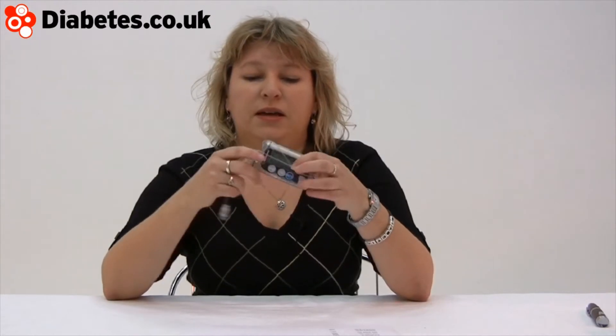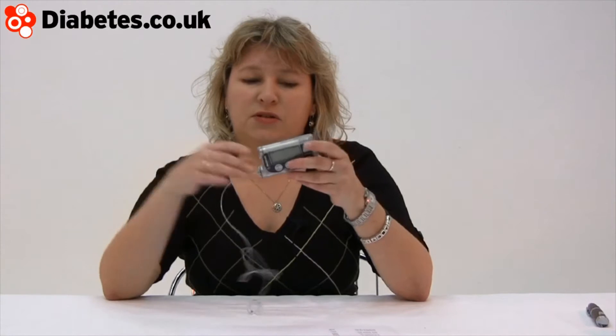The insulin pump has been around for a couple of decades actually, but they were very, very unwieldy to start with. People used to have to carry them on a backpack. They're much, much smaller and more sophisticated. Very similar idea, but you only have one insulin, you don't have to use two, because the pump does two things.